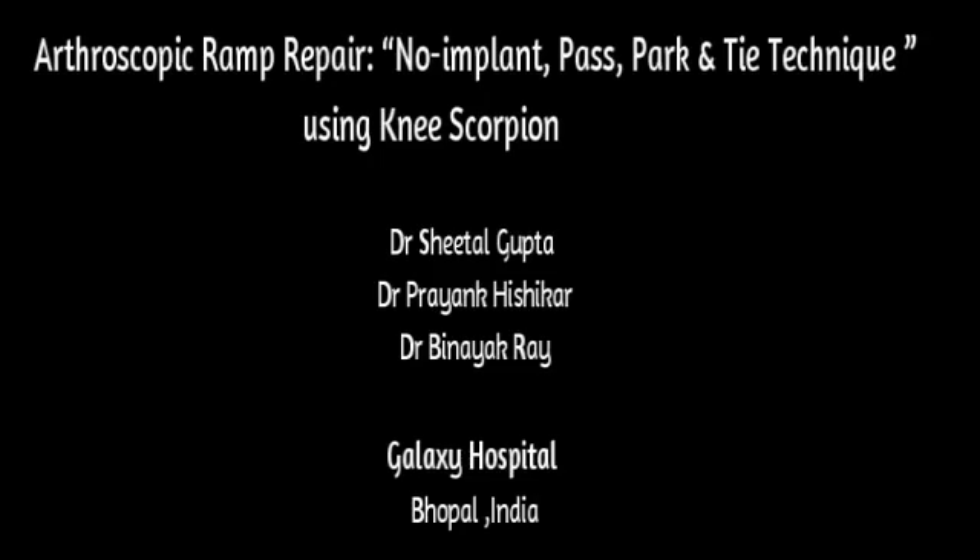We present arthroscopic ramp repair, no implant, pass, park and tie technique using the knee scorpion.